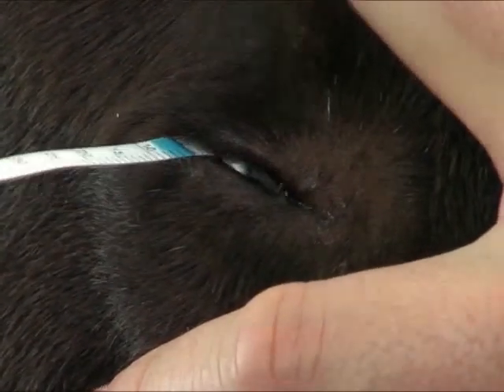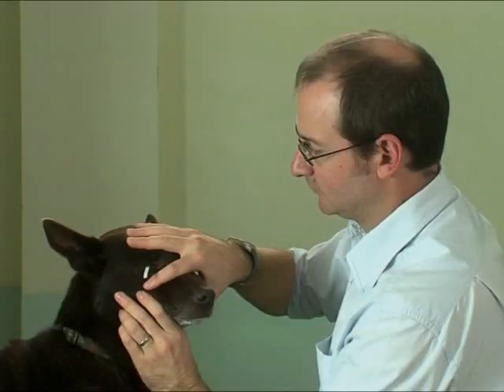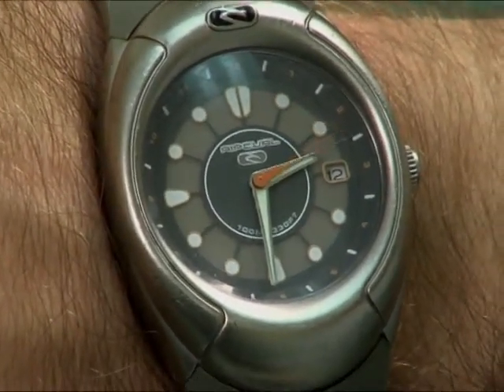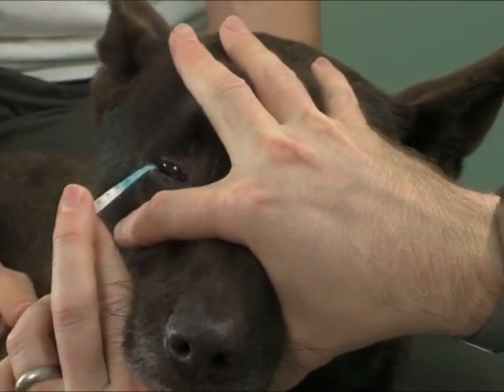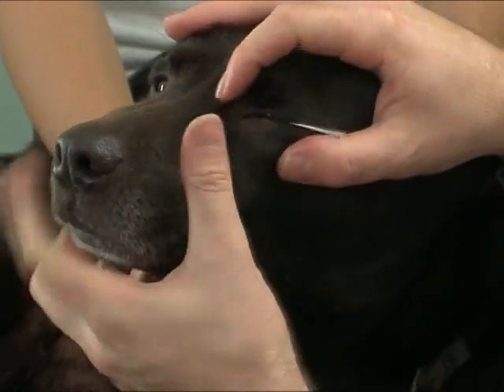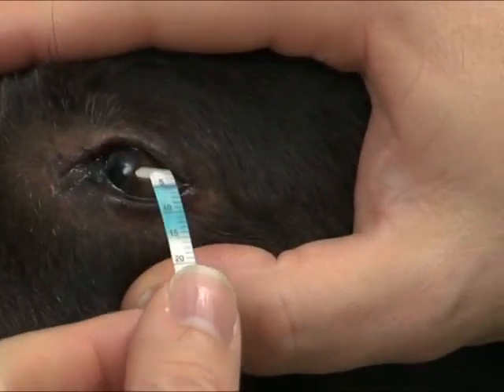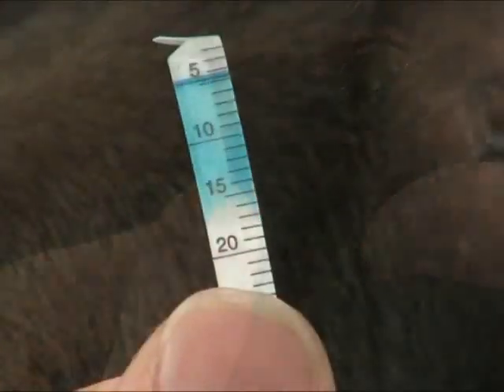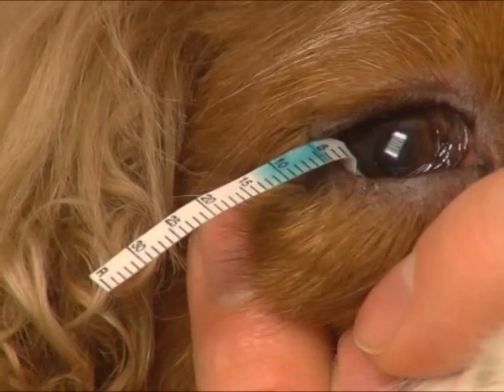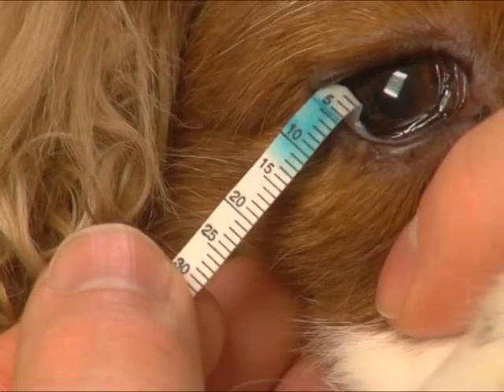The strip should be in contact with the cornea, as this provides the stimulus for tear production. The strip is left in place for 60 seconds. Both eyes should always be tested. A reading of 15 millimeters or greater in 60 seconds is consistent with normal tear production. A reading of less than 15 millimeters in 60 seconds is suspicious, particularly if there are clinical signs of disease.